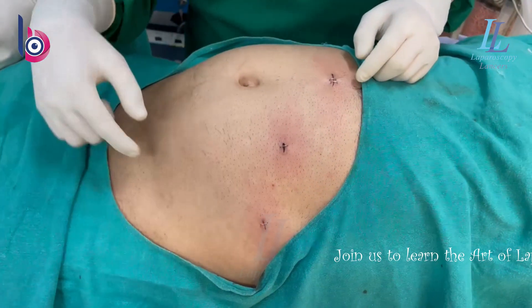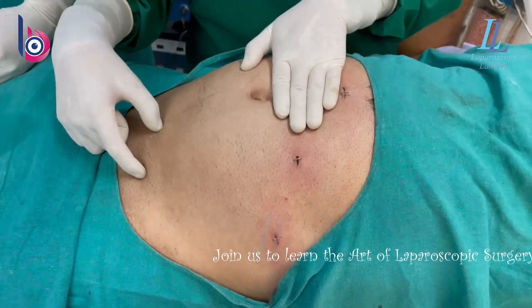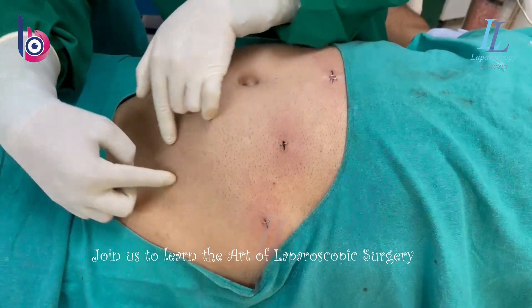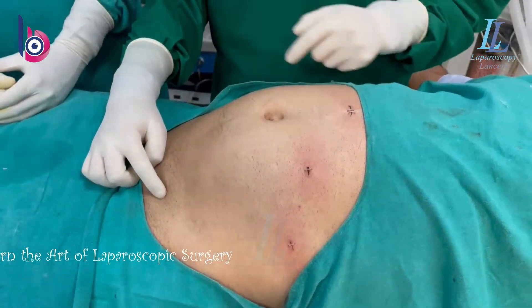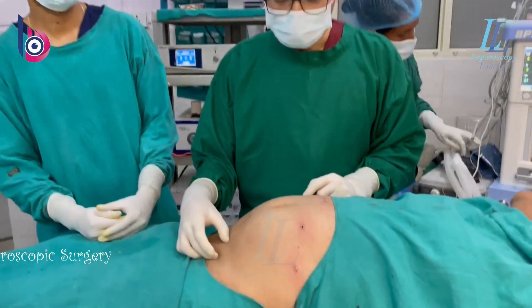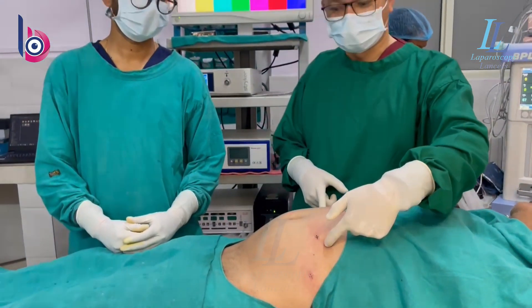In this case, we did an ipsilateral TAPP — the camera port around four fingers above the umbilicus and two ipsilateral ports. So that was the working direction. I'll be showing you how we did the surgery that we got recorded. Please watch this surgery nicely and go for ipsilateral TAPP, which is very easy to do and the ergonomics are also better.